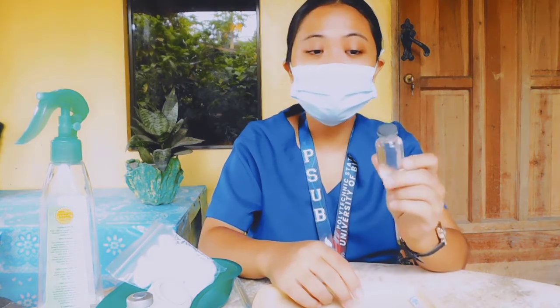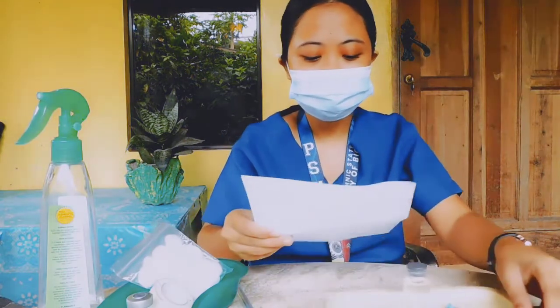And next one is the medication. Here I will be using the vial of hepatitis B vaccine. And next is to check the MAR. So I have the MAR with me.